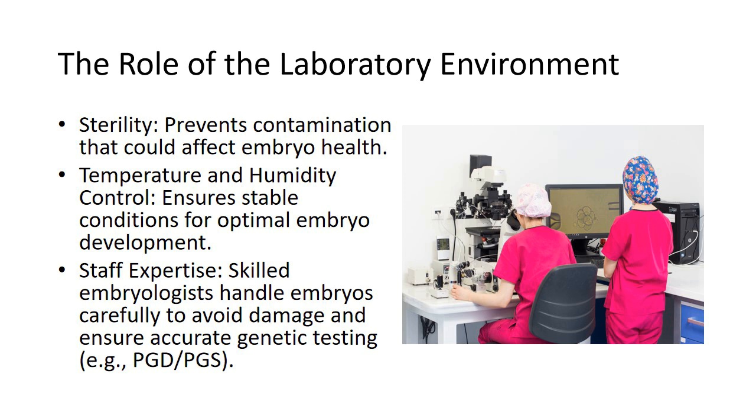Staff expertise. Skilled embryologists are crucial to the success of embryo culture and handling. Embryologists are responsible for monitoring embryos, performing biopsies for genetic testing, and selecting embryos for transfer. Their experience in handling delicate embryos is key to minimizing risks during the culture process.